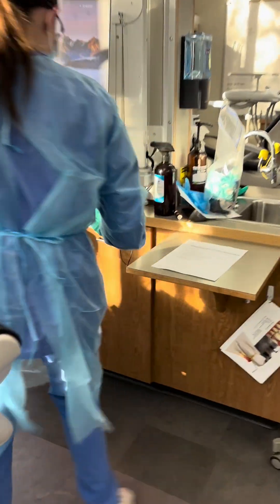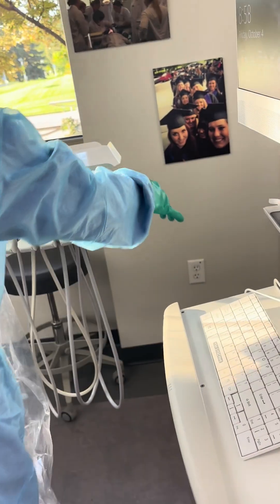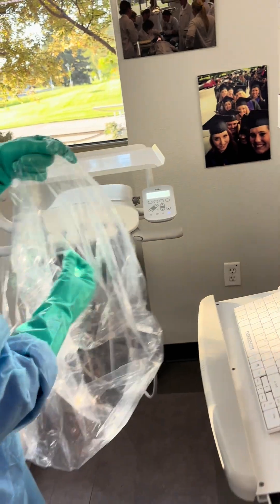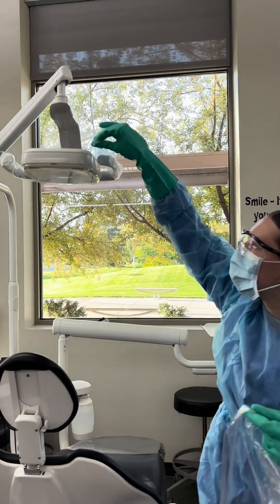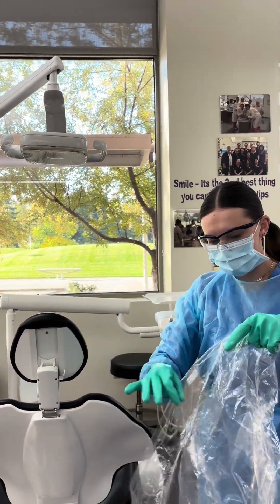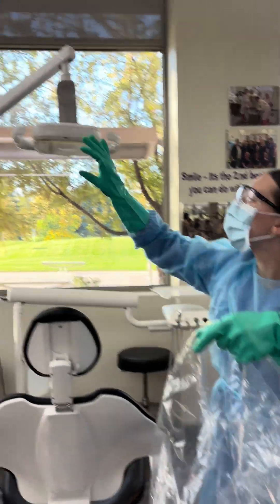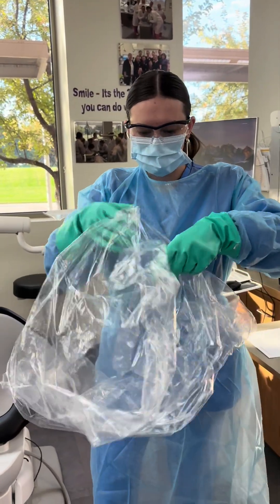And taking the mouse, the screen, and the light handles. And just going to throw that bag in the trash.